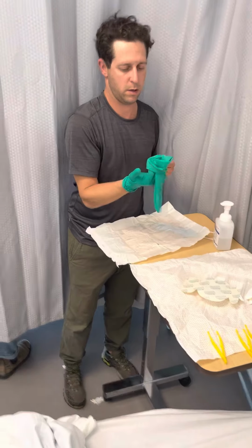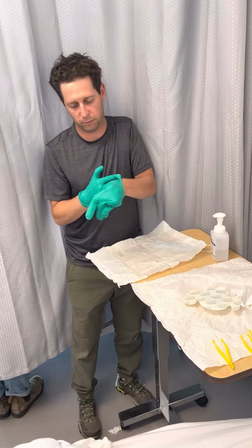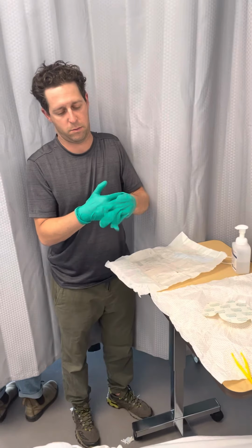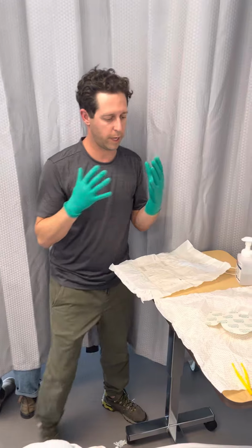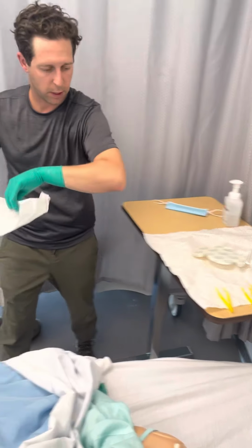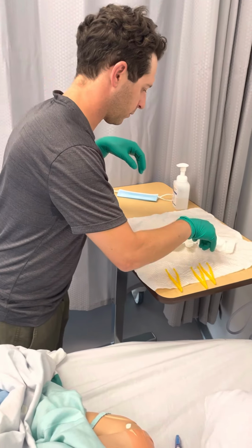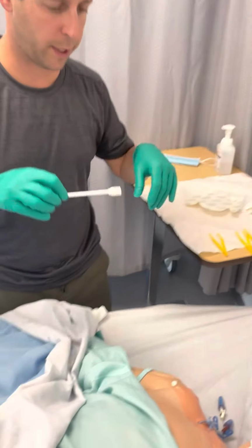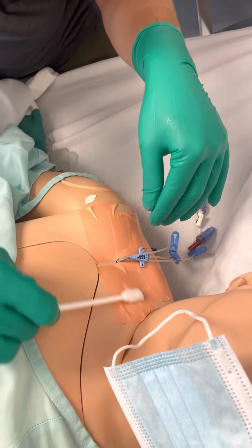Now that I've got sterile gloves, I am able to touch what's on the inside here. I'm going to start with a swab. Be very careful not to touch anything else. We have gloves. This goes into the garbage. I'm going to move away from the site, and I've got 15 seconds.